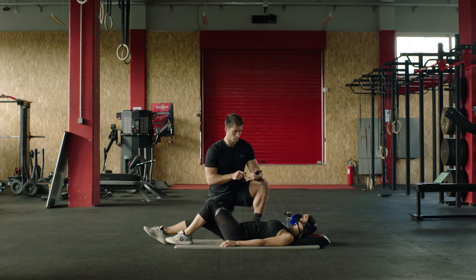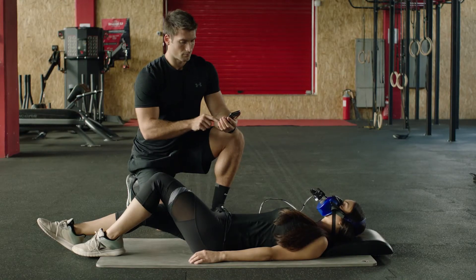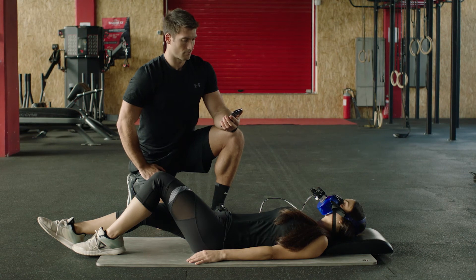The RMR test should be done in a reclined position. The client should have fasted for at least 5 hours prior to the test. They should not have smoked nor consumed any caffeine or energy drinks for at least 5 hours prior to the test.